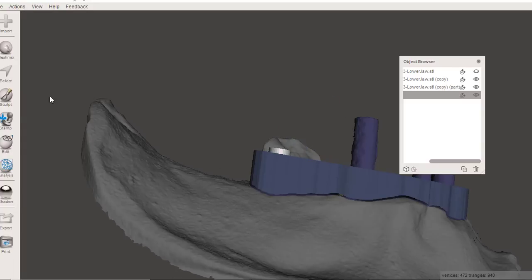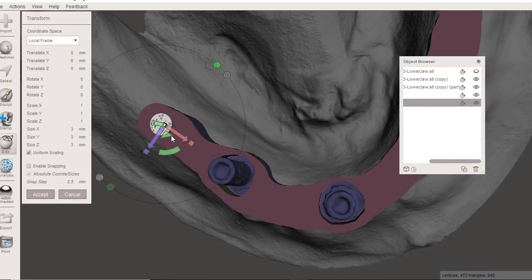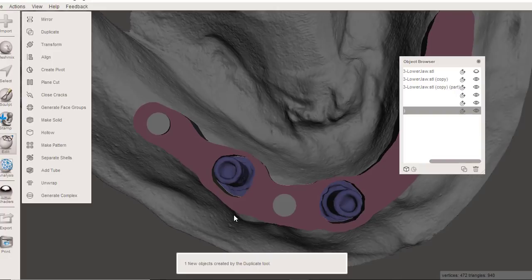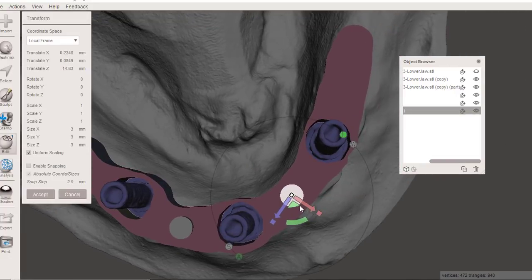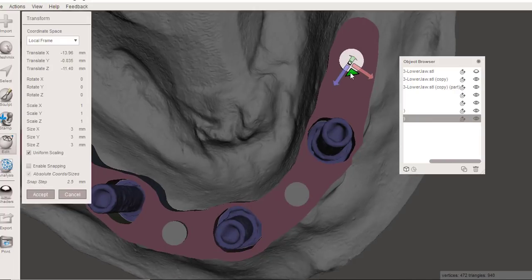Accept it, and then edit and duplicate it. Now push T for transform. This is how you maintain your parallelism of all these. Don't grab any of the rotation sliders. Just grab the triangle here that's in the middle and pull it over to the next place you want your locator. Accept that, duplicate it, T for transform, and repeat. Accept, and then one more time, T for transform, pull it back.